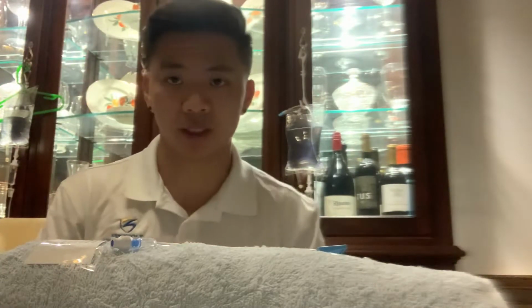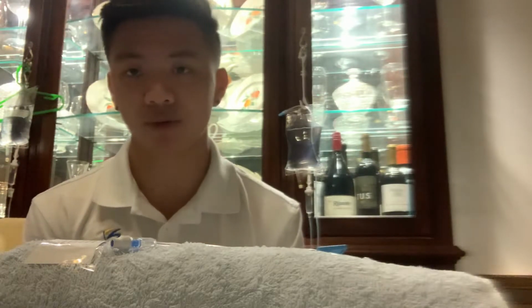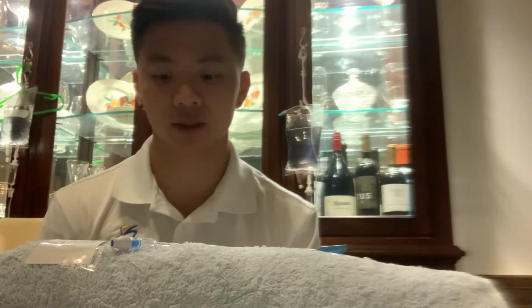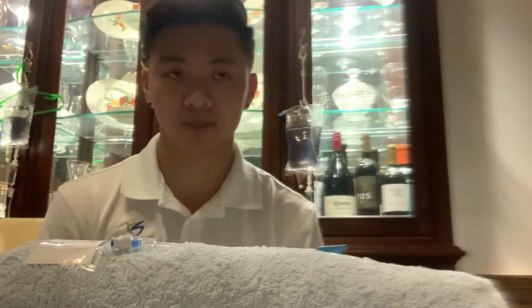So after proper hand hygiene, I'm just going to go ahead and inspect the IV site for any infiltration or phlebitis, which there's none. So I'm going to go ahead and move on. I'm going to go ahead and check the IV bag for any particulates or cloudiness, as well as the expiration date. I see it's not expired, so I'm gonna go ahead and label the IV bag, and I'm gonna make sure to prepare the medication properly by making sure I have the correct IV solution, which is 0.9% sodium chloride, which it is.